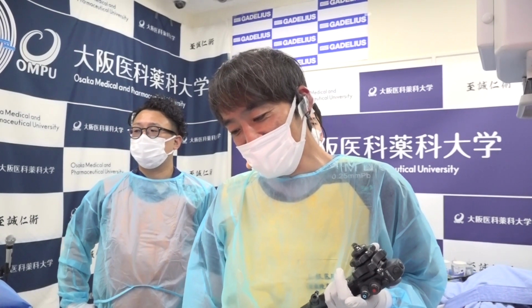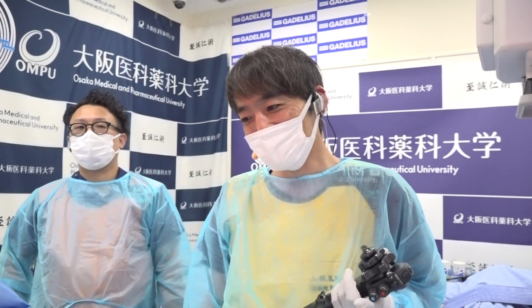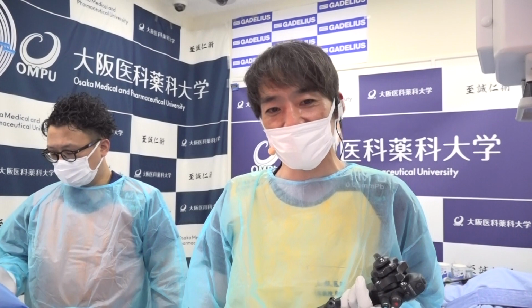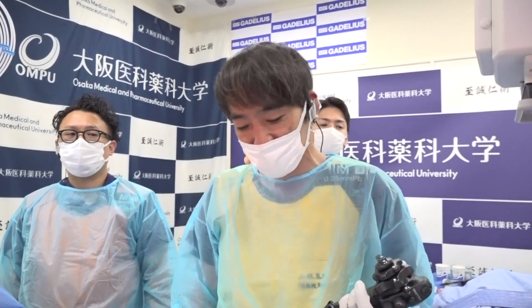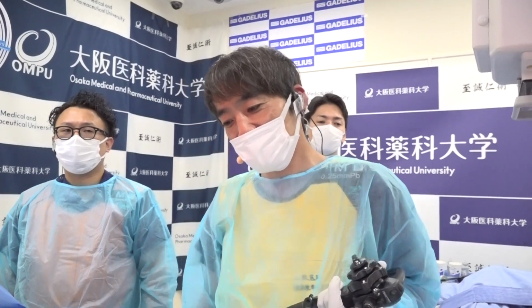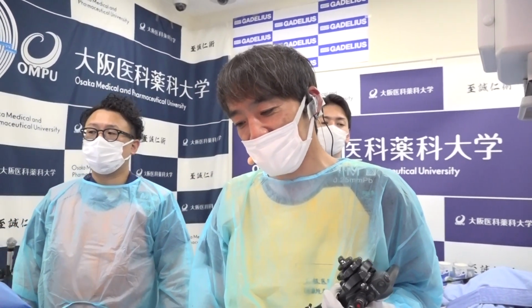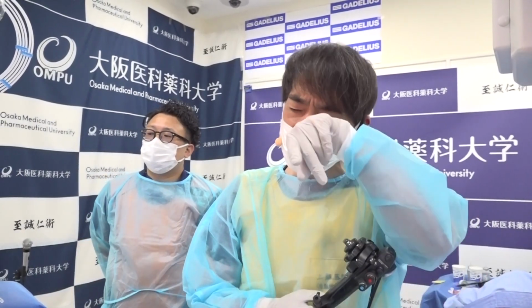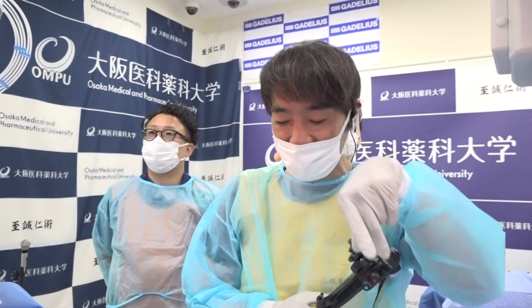So in my opinion, EUS HGS is better, but surgeons recommend to do the EUS CDS using Hot Axios, but we cannot use Hot Axios. Therefore, surgeons agree with stent deployment. EUS HGS is agreed.